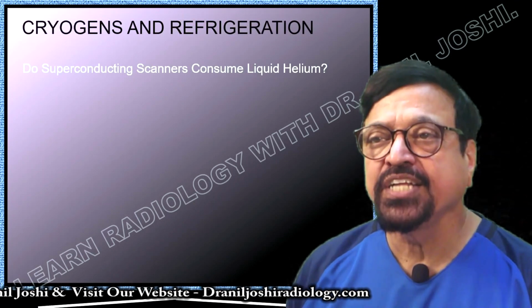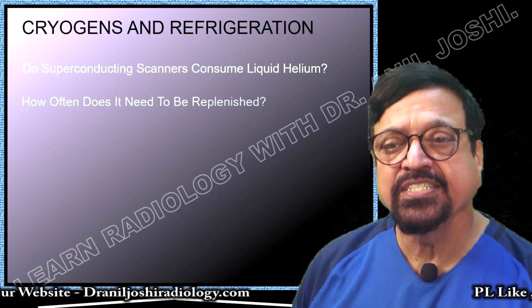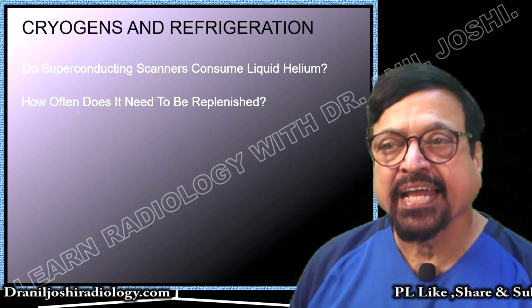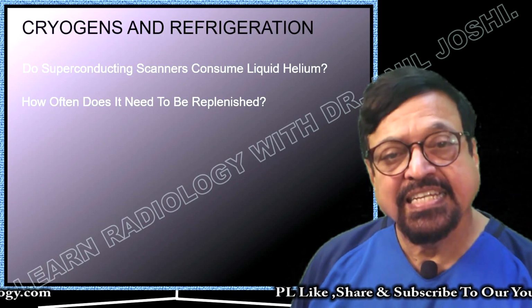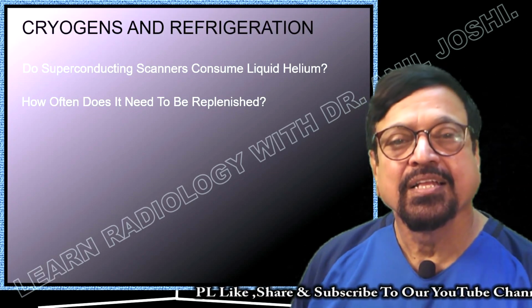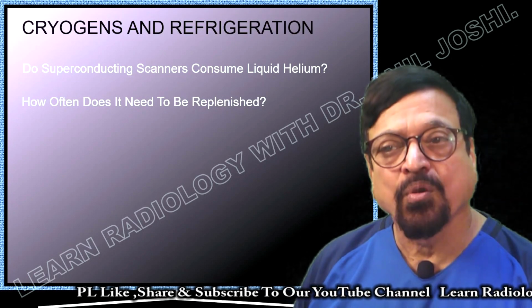Now, what are cryogens and refrigeration? Do superconducting scanners consume liquid helium? The answer is no. The superconducting magnet does not consume helium. Now, how often does it need replacement? If replacement is needed, it is not because the helium is consumed by the superconducting magnet, but because of losses from other components.